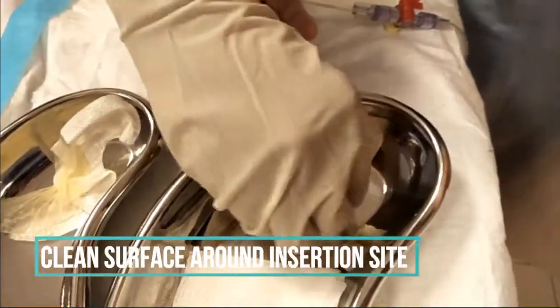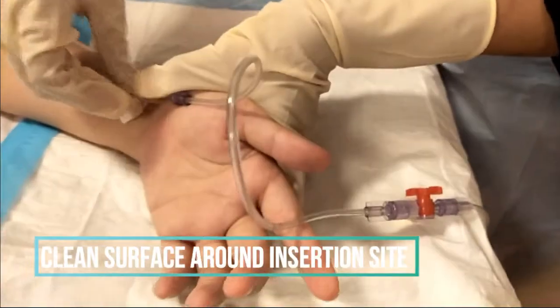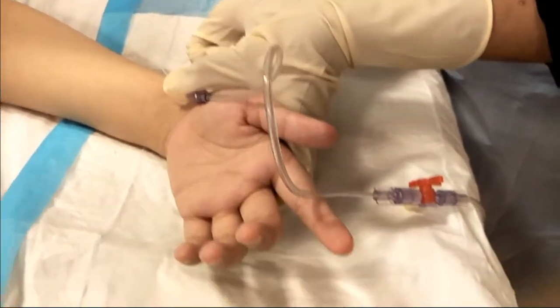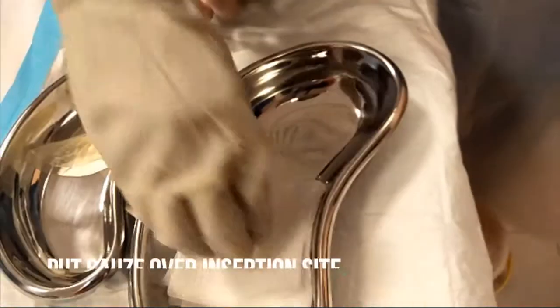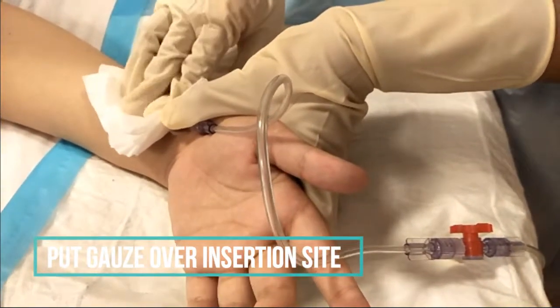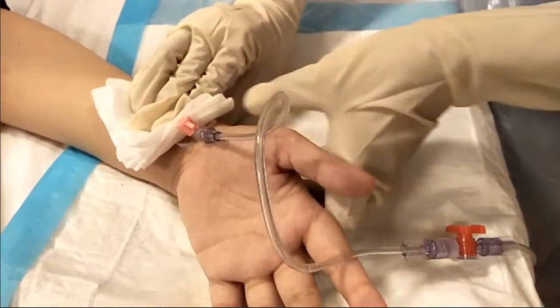Clean the surface of the skin around the insertion site using alcohol swab. Put the gauze above the insertion site and put pressure on the gauze.